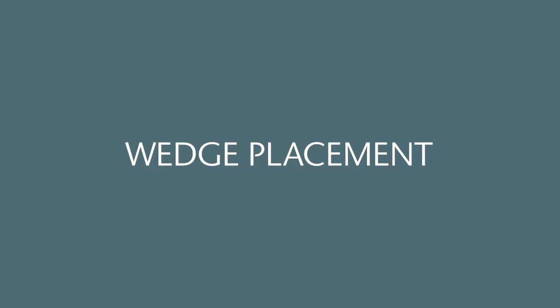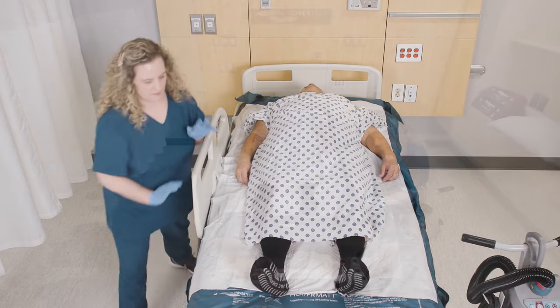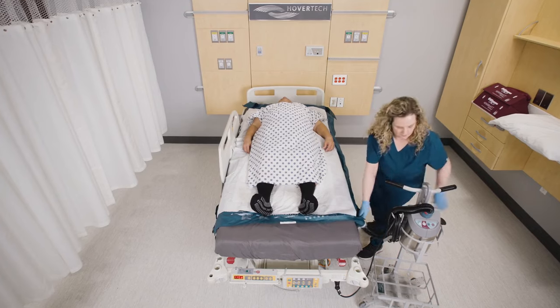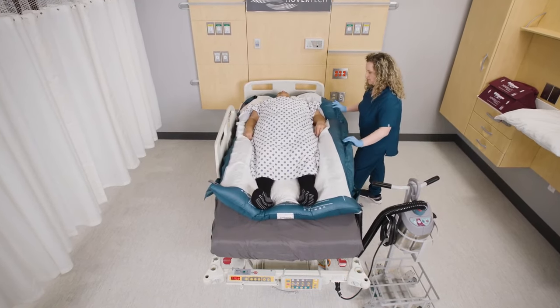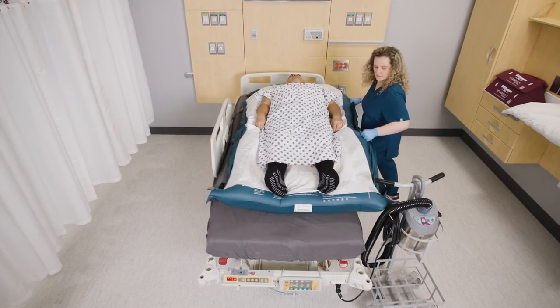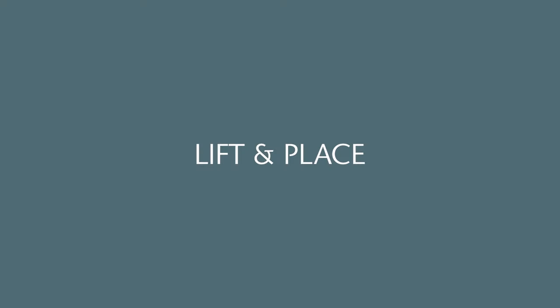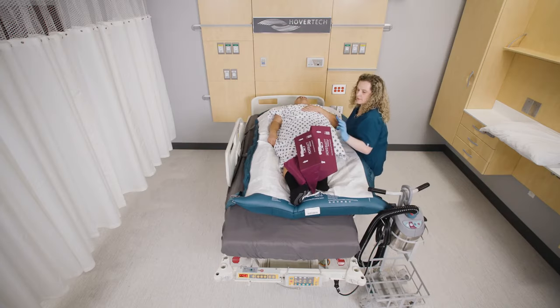Wedge placement. If using one caregiver, side rails must be raised. Ensure the patient is centered and inflate the Pro's AIR, then slide the patient as close to the edge of the bed in the opposite direction of the turn. This will allow the patient to be centered on the bed when repositioned on the wedges. Lift in place — hold the edge of the inflated Pro's AIR and gently lift to insert the wedges.